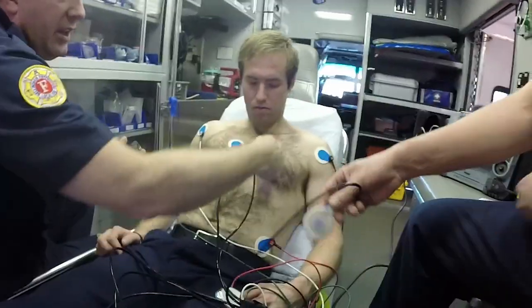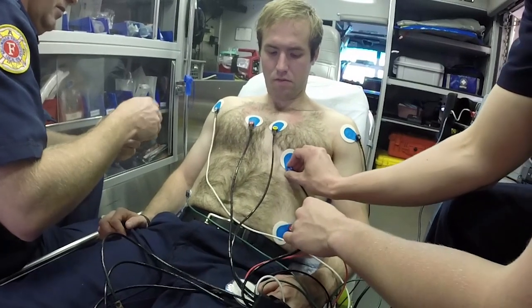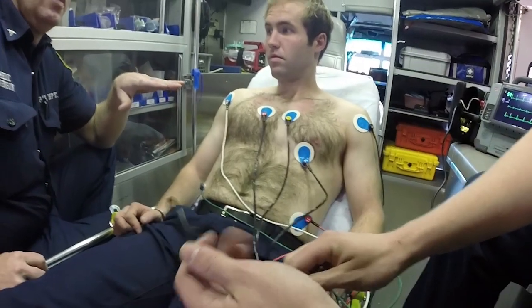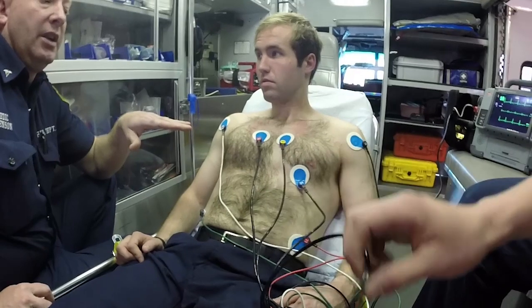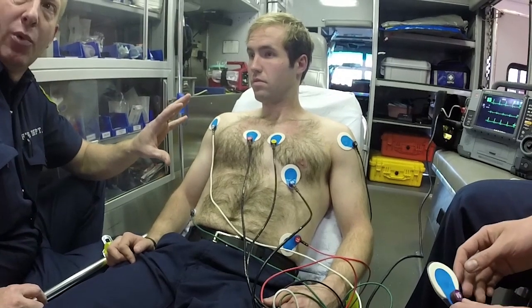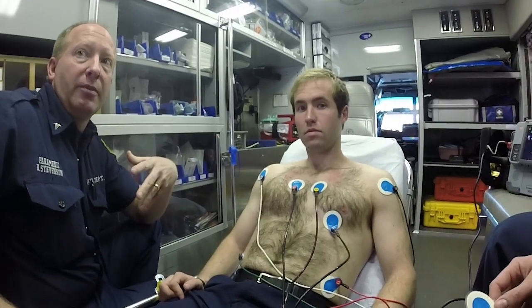V4 is going to be mid-clavicular and right in that crease right there. This one's the awkward one on women sometimes — it would be kind of underneath the breast, right on that fold. Just so you guys know, we used to be instructed that we had to take all bras off, and we don't anymore — mainly to protect modesty. We get a good enough picture without worrying about that, and the hospital will do it properly later.